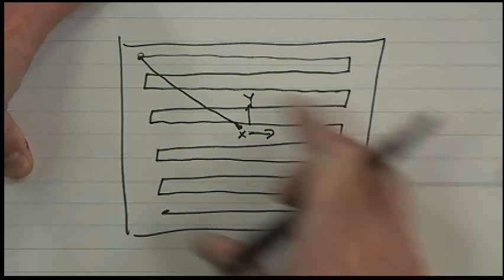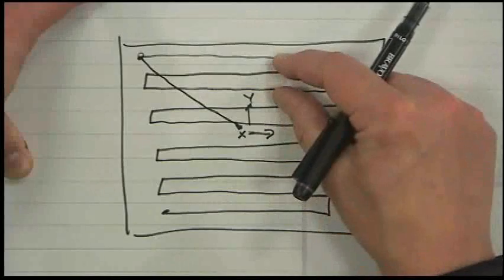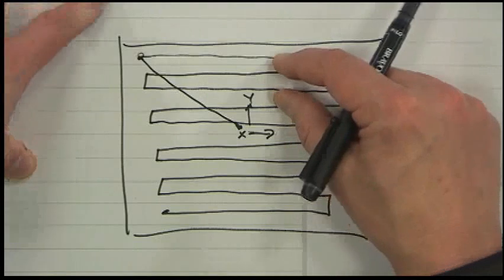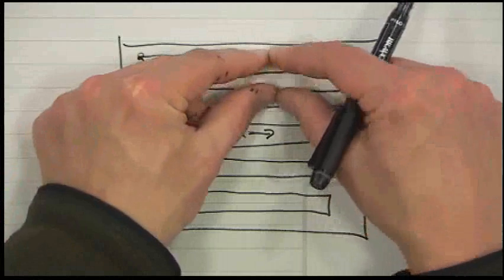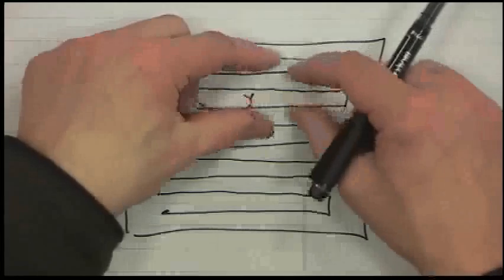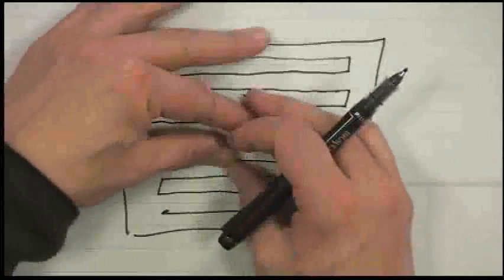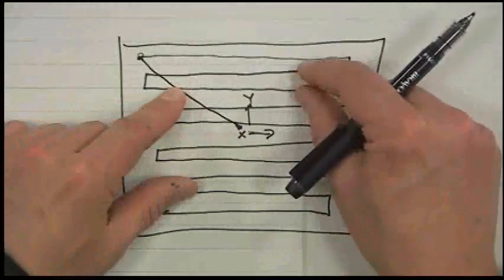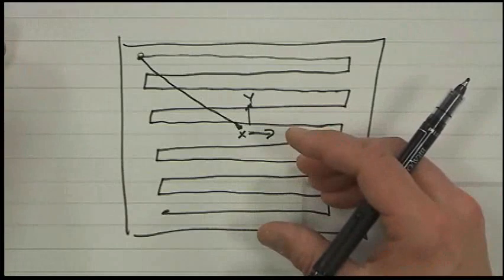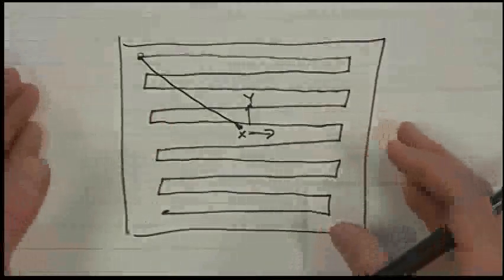But if you have to scan a big area, that's kind of slow, right? Now, if you make these things too far apart, what's going to happen? Making this small in frequency makes it big in space, so making these steps big in frequency makes it small in space. So your field of view goes down. The largest spacing is determined by how big the person is. If it's a big person or object you're scanning, you need to put these close together. Remember, it's the same thing: something big in space is small in frequency.